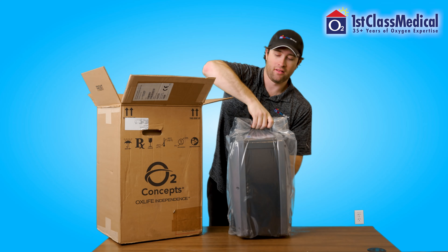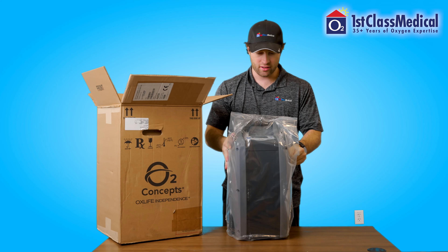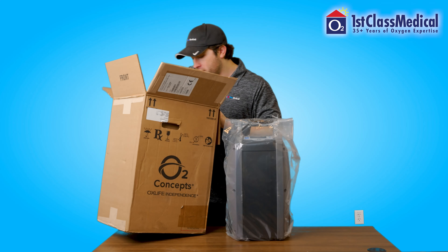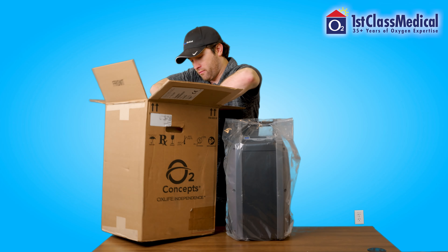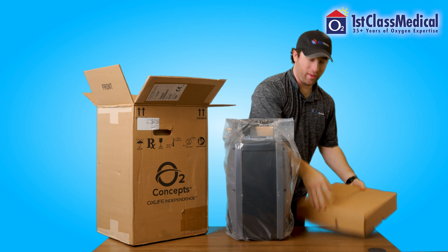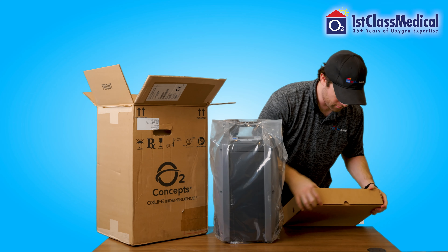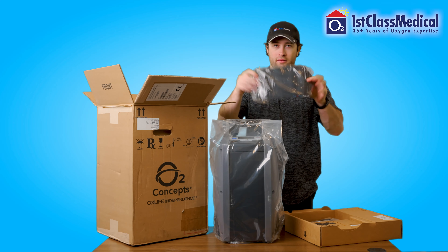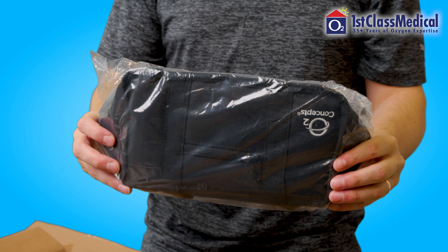You will have, of course, the O2 Concepts OxLife Independence Portable Oxygen Concentrator. There's a little box in this big box that's going to have all of our accessories. In this little box, you're going to find an accessory bag to carry any extra accessories you may have on you, like batteries or chargers.